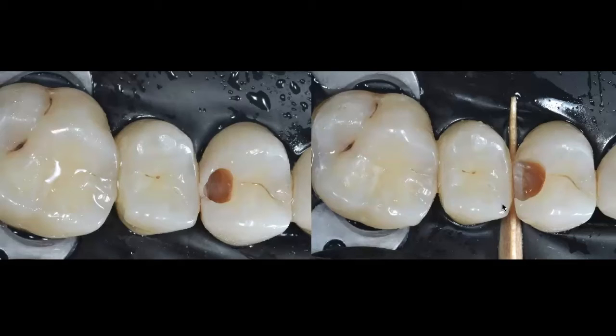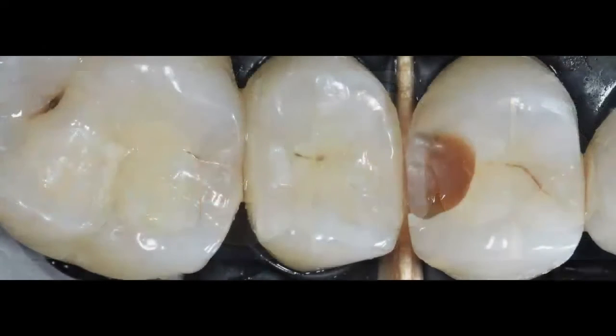But if you're not using any technique and you would like to try one, this is one that gives you very good view of the operative field at the same time that it helps you accomplish that separation between the teeth. And again, just a little bit of a closer photo. You can see one more time that intact proximal wall of the neighboring tooth. But again, the separation, maybe a quarter or half of a millimeter, that I was able to accomplish between these two teeth. Now I can literally open that box from buccal to lingual, and deepen the box as well to get rid of any soft enamel left on that gingival floor.